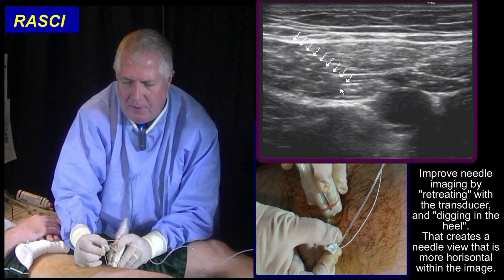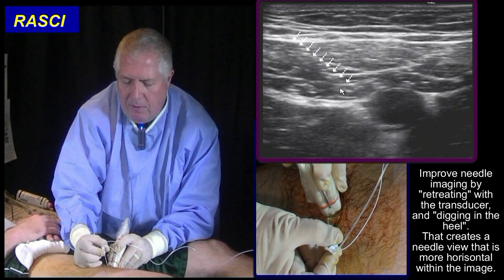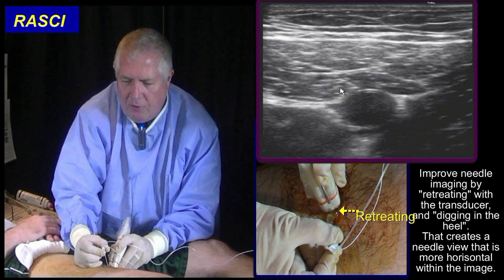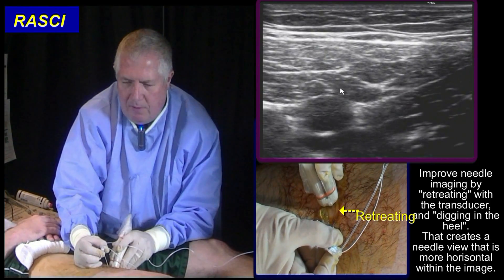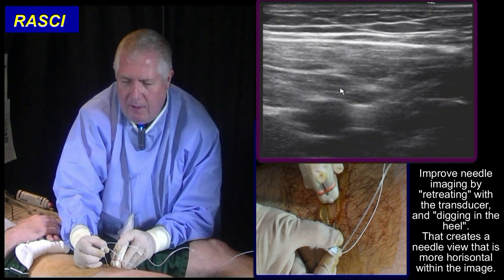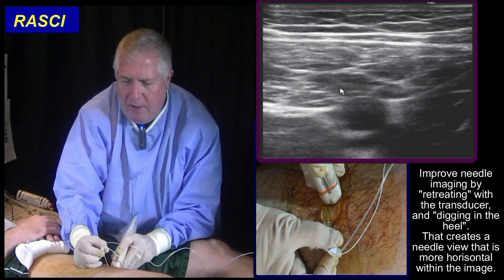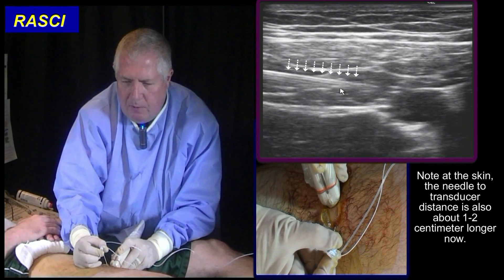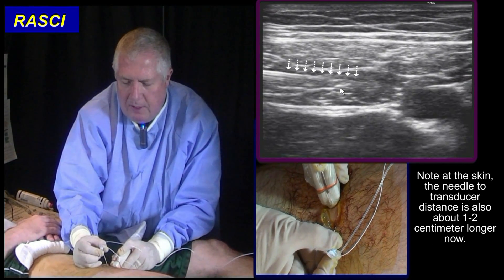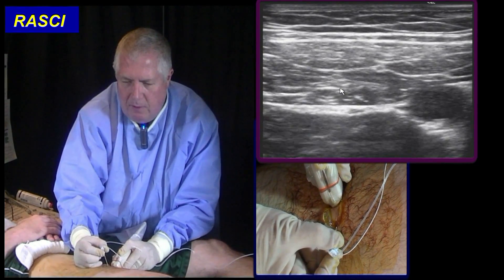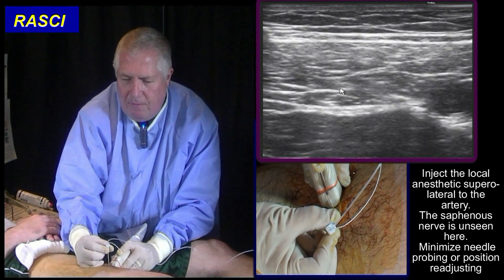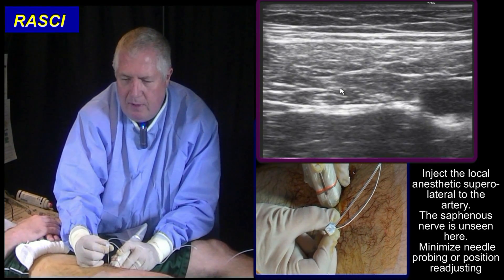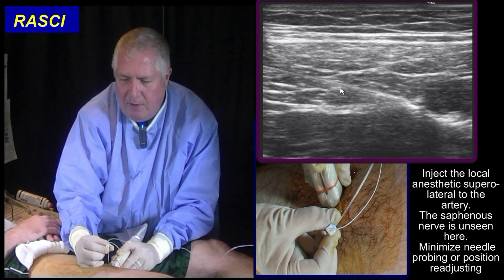Watch what I'm going to do. I'm going to retreat with my transducer so the image moves across. I retreat and then I dig the heel in and I look back. What that will do is make my needle more horizontal, and all I want to do is get next to that artery. I may feel a little fascial pop. I aspirate — reject a bit of dextrose water.